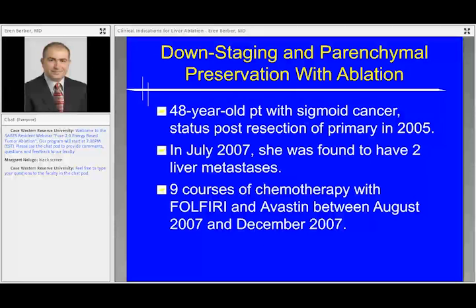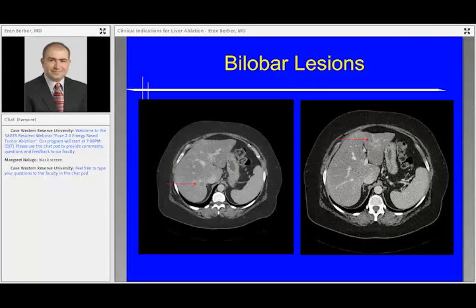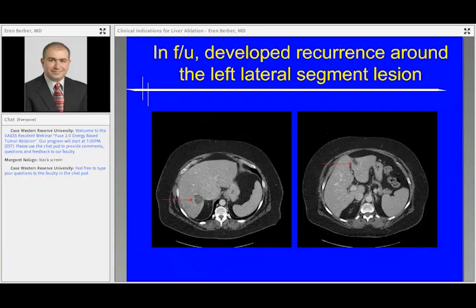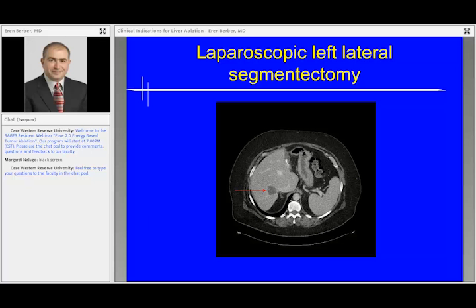Downstaging and parenchymal preservation is a concept that I think needs to be investigated. For instance, this patient had colorectal cancer, had the primary resected, had chemotherapy, and had two lesions. You can see one in segment 7, the other one in segment 3. And our usual approach to this patient would have been a two-stage hepatectomy, but the patient was well informed and said, I want you to ablate, I'm okay, I want to give it a chance. And after ablating these lesions, we started to follow the patient closely. Interestingly, the lesion in segment 7 did not recur, but the one in the left lateral segment recurred.